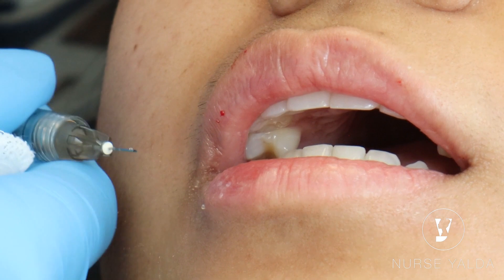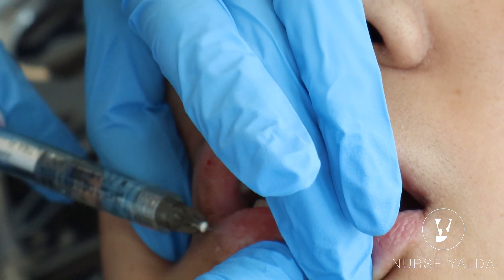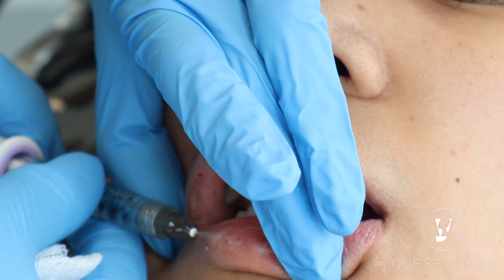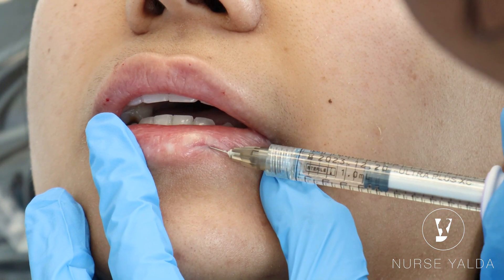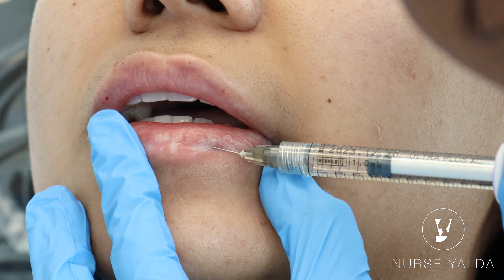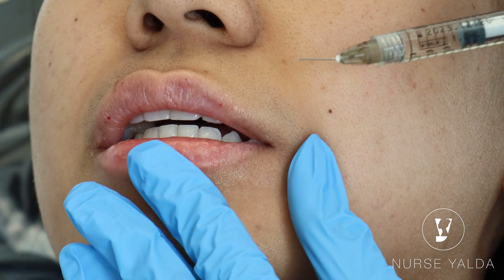At the corner of the lip, remember this is an area where when you're pushing, you want to lift upward. Go exactly from here, give yourself support — push and come out slow, slow, slow. Nice job. What you're using is Juvederm Ultra Plus — it gives you nice augmentation. One more linear thread for the corner of the lip.